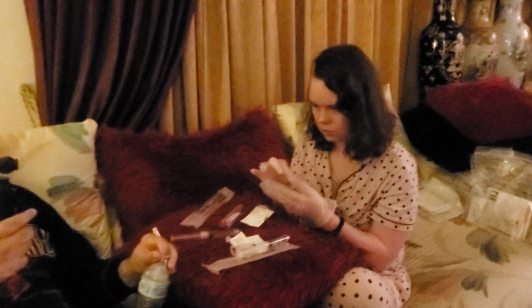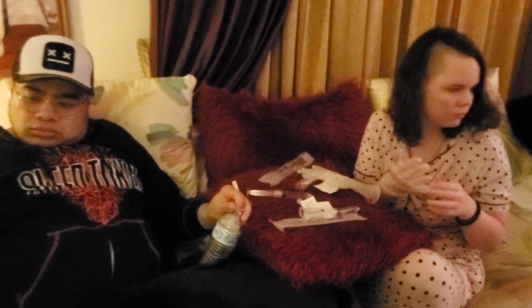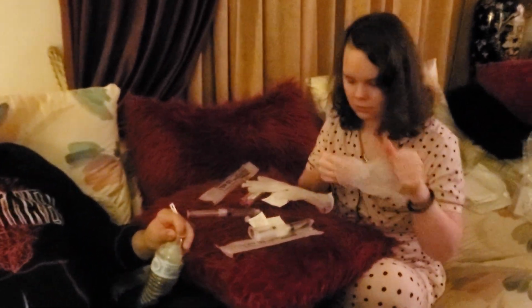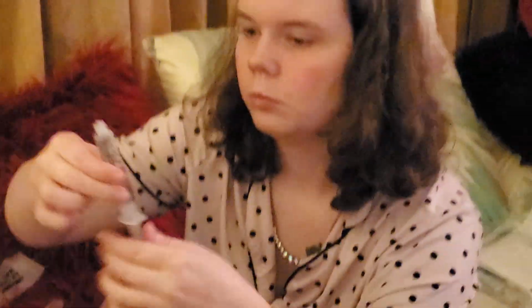Very nice, Bree. If I am your clinical instructor, then I will not give you 100%, but I'll give you 99.9%. You did very well. Very well, Bree. So that's blood draw. Amen. Okay. Very good.